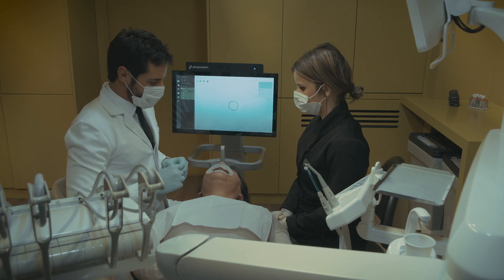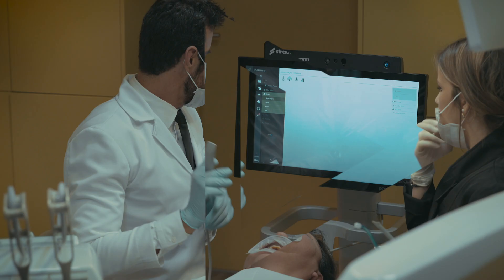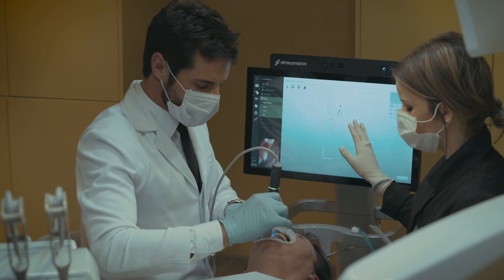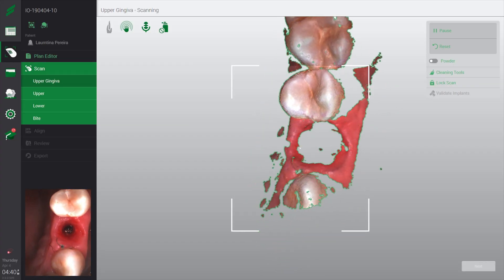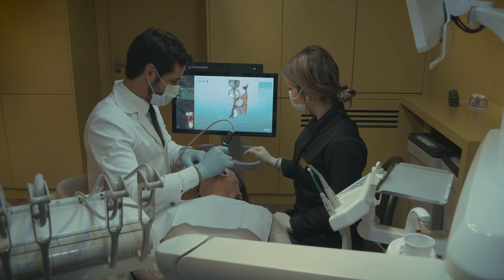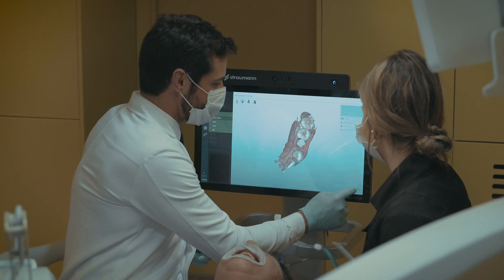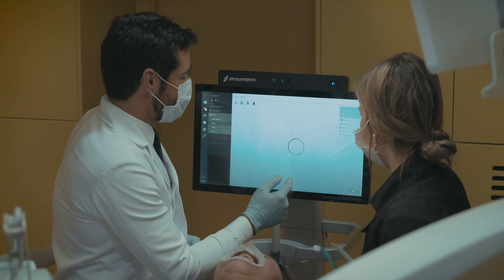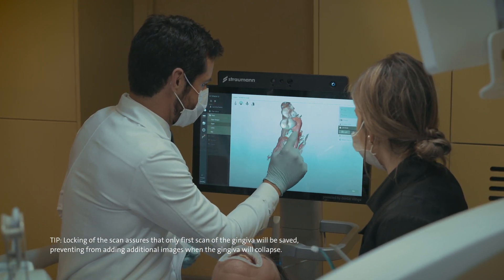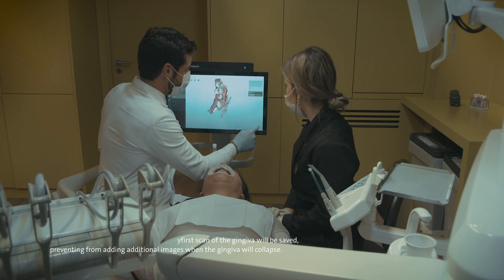Here we need to remove the provisional crown first. Now you start by scanning the upper gingiva — you only scan the emergence profile and the lateral teeth that you want. Now we will lock our scan. You have that option. Then you do a circle on the emergence profile and proceed to the next step.